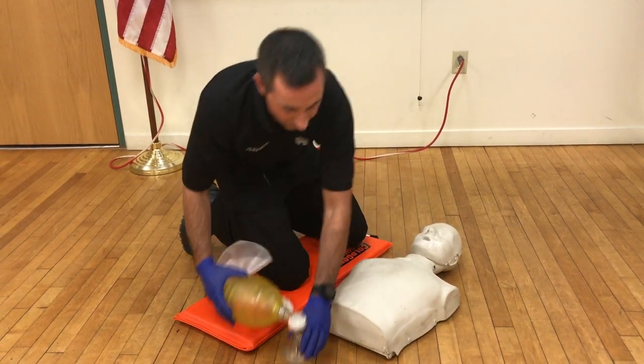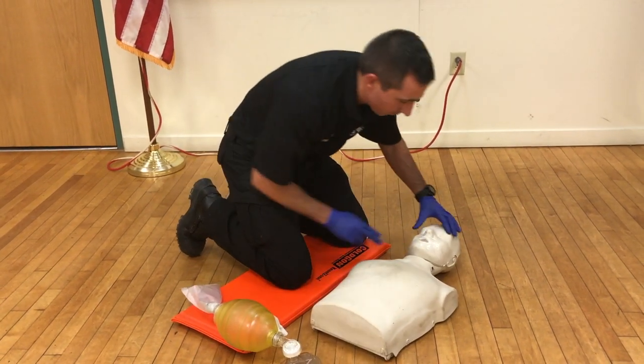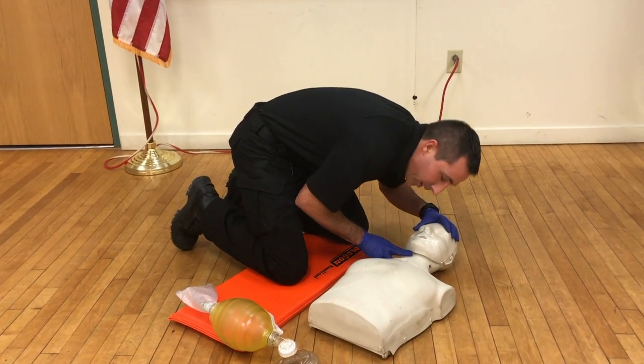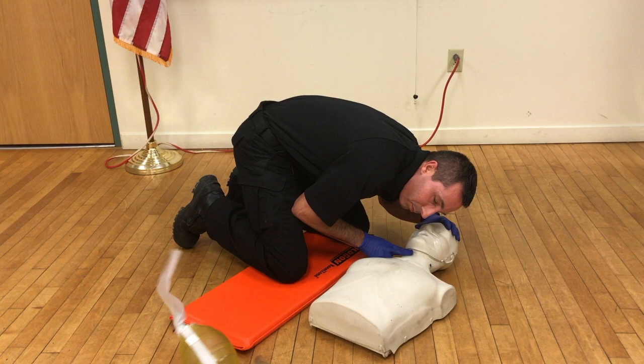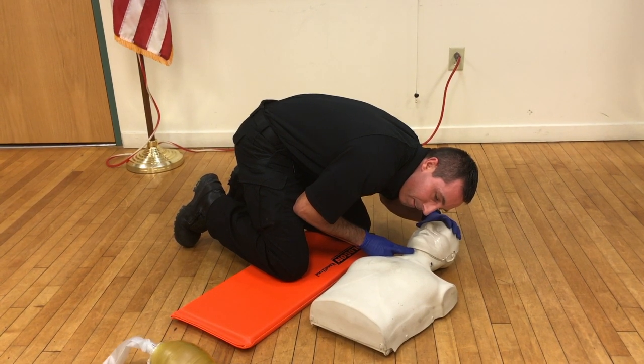That was my fifth cycle. So I'm going to reopen my airway and I'm going to recheck for pulse and breathing for no more than 10 seconds.